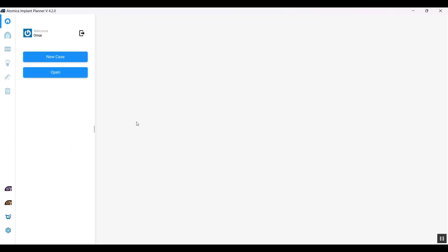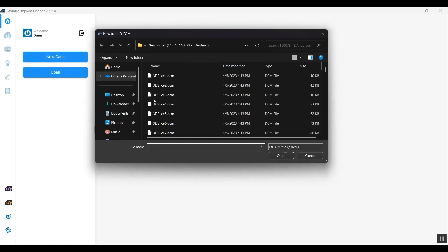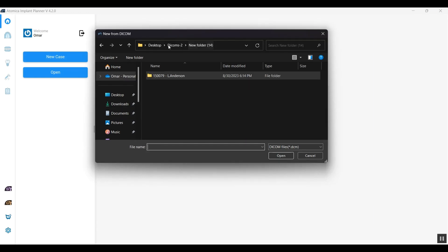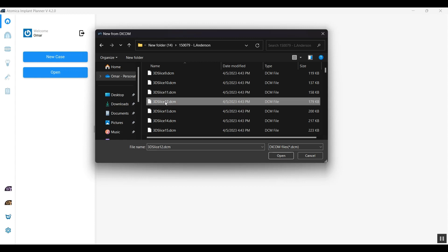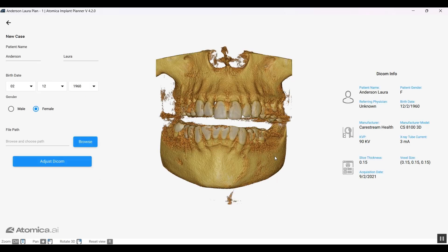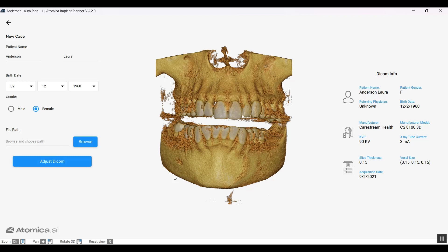Let's take a very simple case. Our software supports single DICOM files and multiple DICOM files. This is an example of multiple DICOM files that our software brings together and renders pretty quickly and smoothly. On the right-hand side is the patient information along with the scan information, and on the left-hand side is the patient information that you can edit.